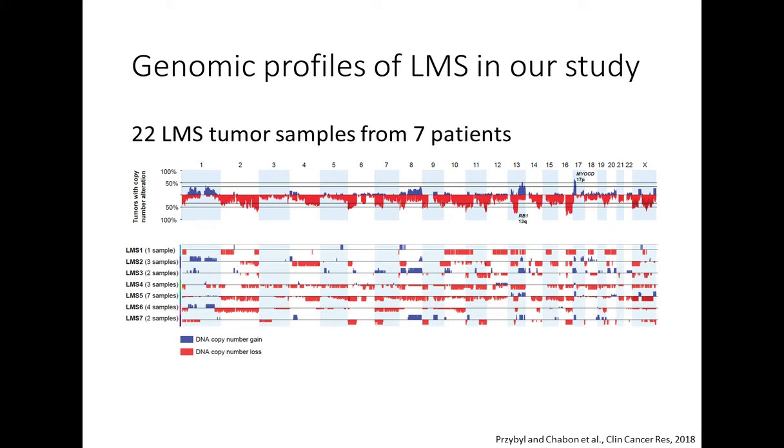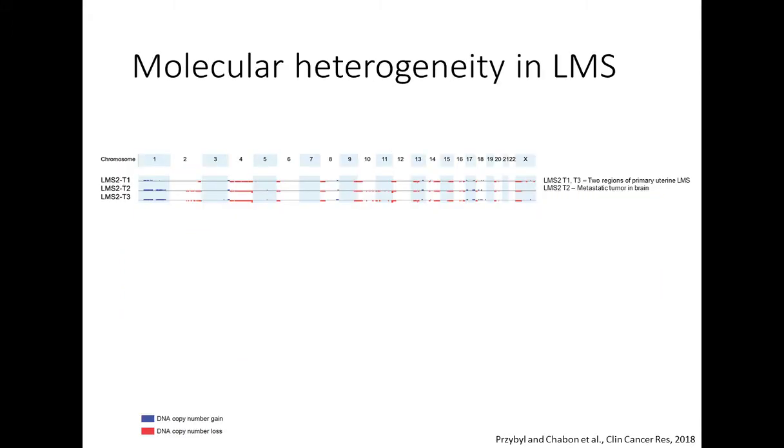Based on applying diploid recentering and the analysis criteria that I described in the previous slides, we identified the following abnormalities in our leiomyosarcoma tumor specimens. The most frequent alterations included loss of RB1 tumor suppressor gene and amplification of myocardin gene, which is in agreement with the previously described leiomyosarcoma profiles in the literature.